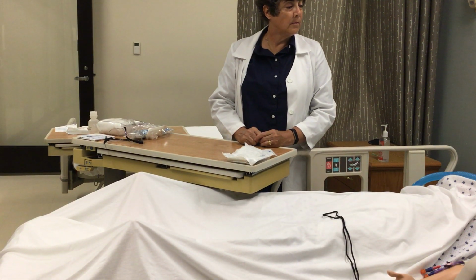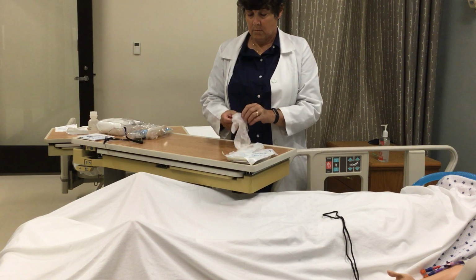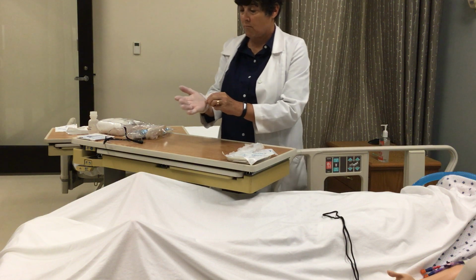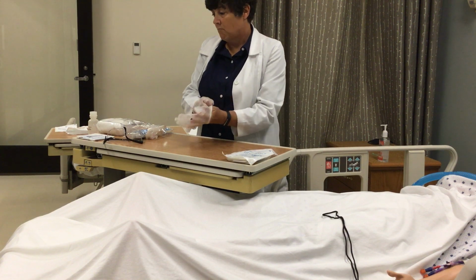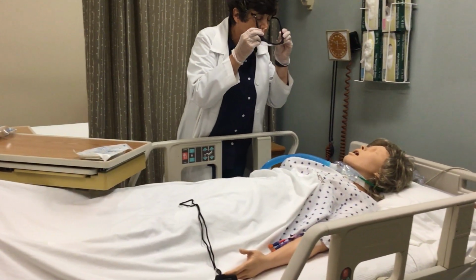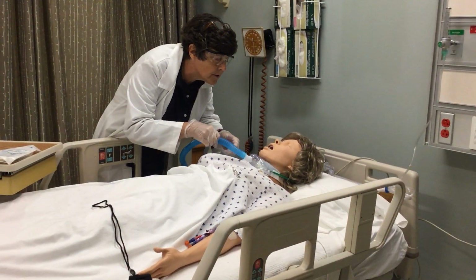To look for excessive peristomal secretions, apply clean gloves and face shield if needed. Examine the tracheostomy site for soiled or damp dressings. Ms. Cruiser, I'm going to take off your dressing, and I'm going to take a look at the skin around your site.